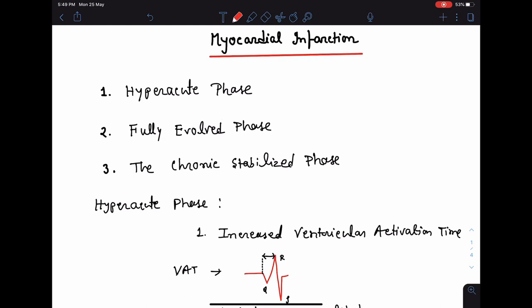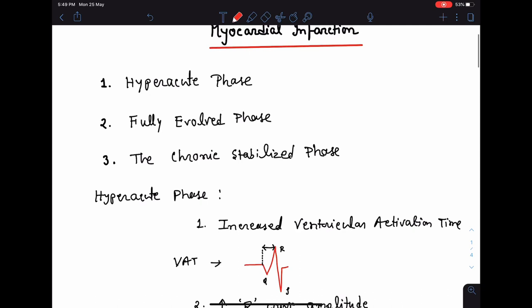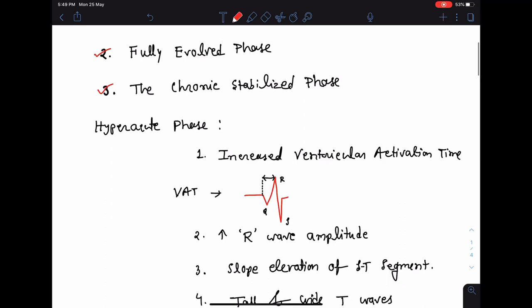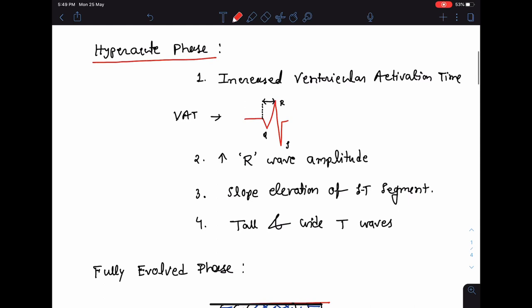In this class we are going to talk about myocardial infarction. The various stages of myocardial infarction are easily recognizable from ECG through the following phases: first is the hyper acute phase, next is the fully evolved phase, and then the chronic stabilized phase. These are the ECG changes in each phase.